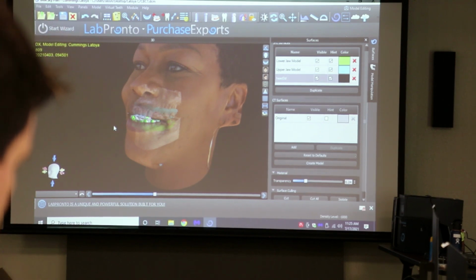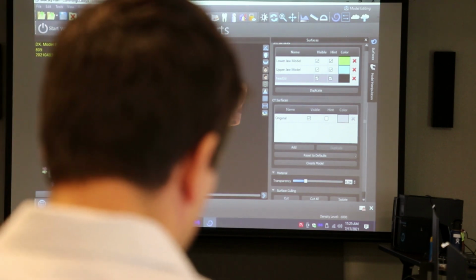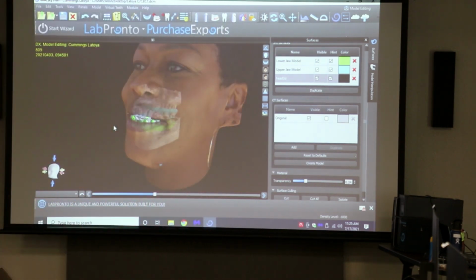So this one is different because you don't get the points. Remember, you just have to do that, so it's not as good. And then the downside about this is, that's going to mess up because you're circling back on itself.